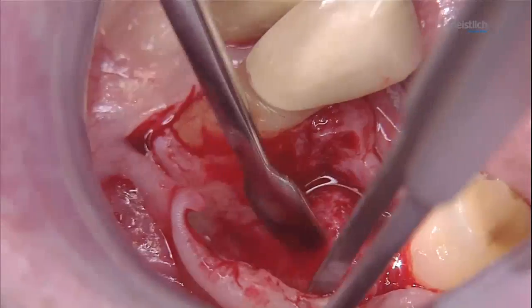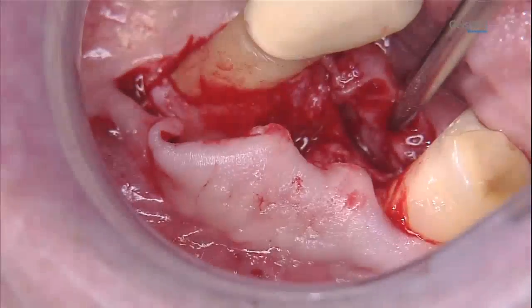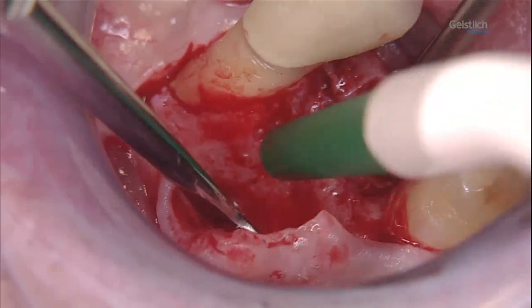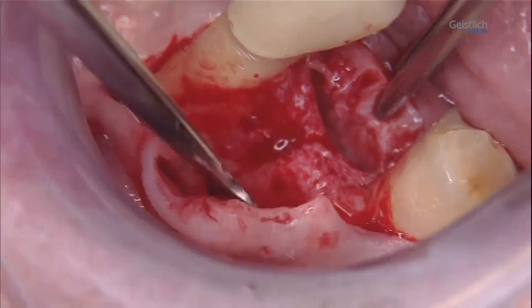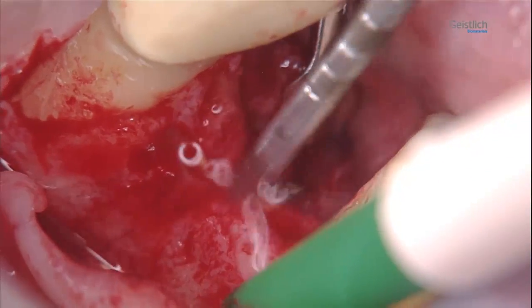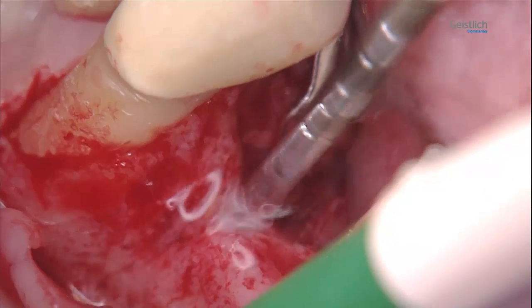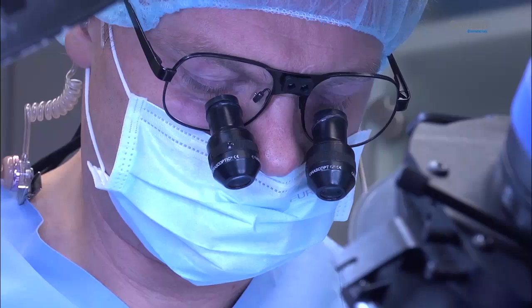The ridge defect now comes into view. The extraction socket and the buccal bone plate, with some tissue loss in the mesial area of the defect, are clearly visible. We prepare the implant bed with a pilot drill under irrigation, following the axial direction of the original tooth 3-4, with the adjacent teeth 3-3 and 3-5 providing additional guidance.